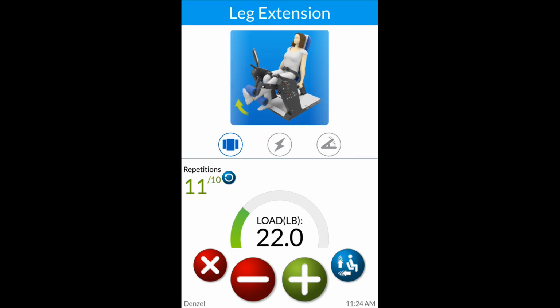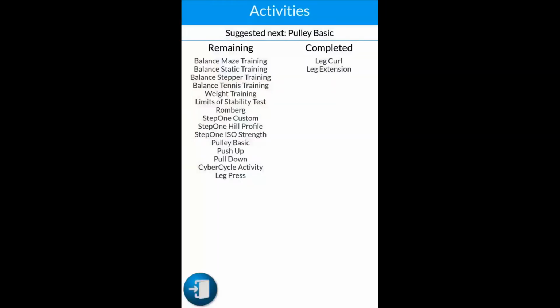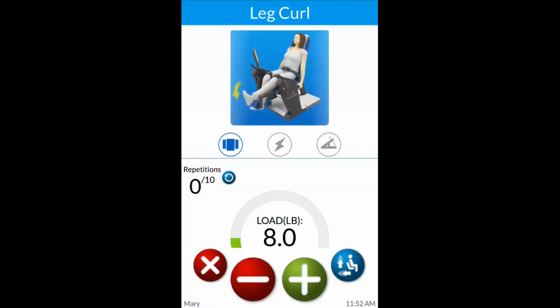Then, after you perform the activity, it is shown as completed on the right side of the screen. Next, we will look at how to set the target power for a client. Power is calculated in watts, which is work divided by time, or the work you do divided by the speed in which you do it.